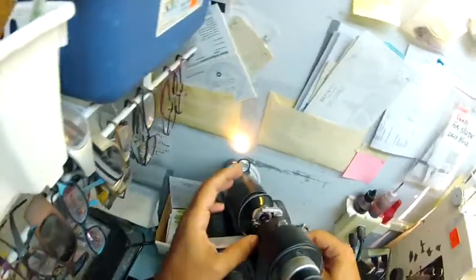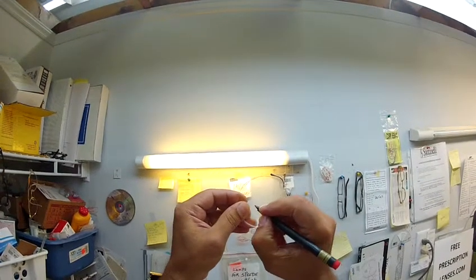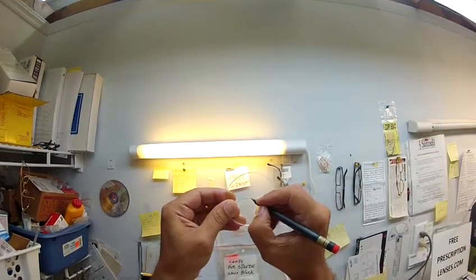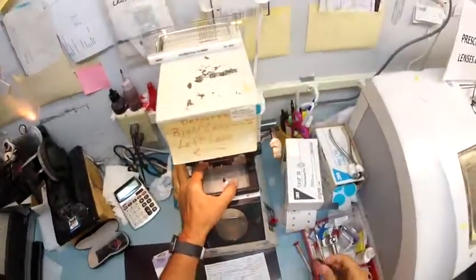And now I'm going to put 3 dots on your lenses. In fact, I need to put some more ink in my machine. They're so light you can't see them, but I will do that for you. There's a dot, and there's one, and this is the right lens. So I'll put an R on there.